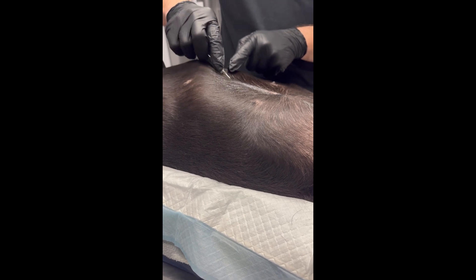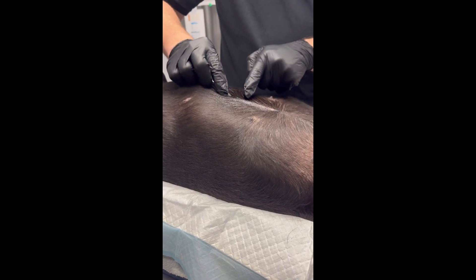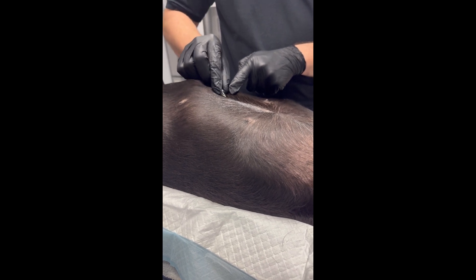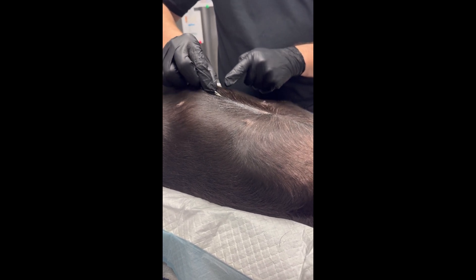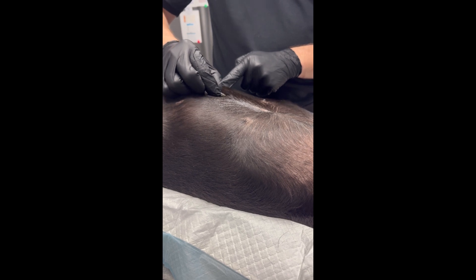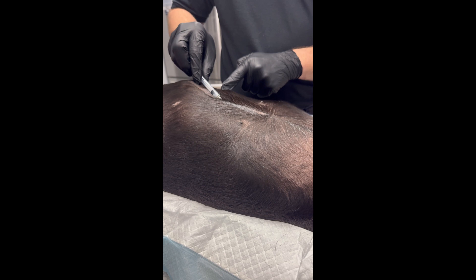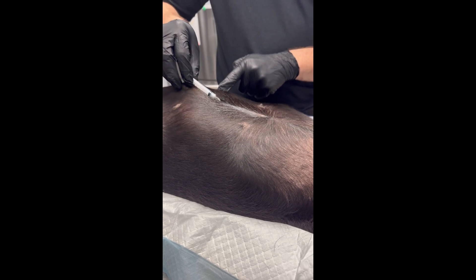I'm going to go just inside the abdomen up against the body wall. Sometimes I'll even lift up a little bit to know that I'm in there. And I'm just going to fan just ever so slightly into that falciform fat pad. You'll see that I'm injecting as I'm fanning — it doesn't bother the dog at all.